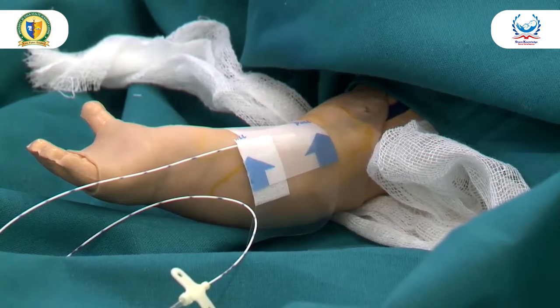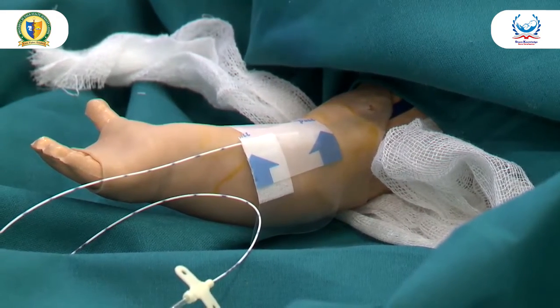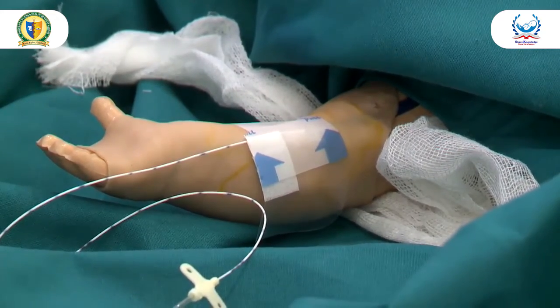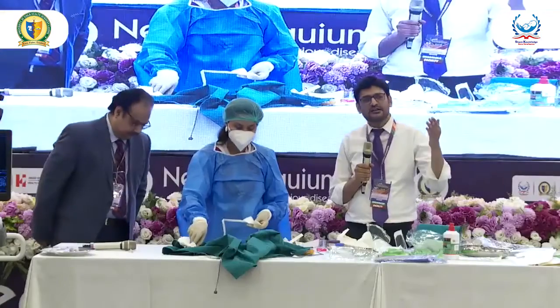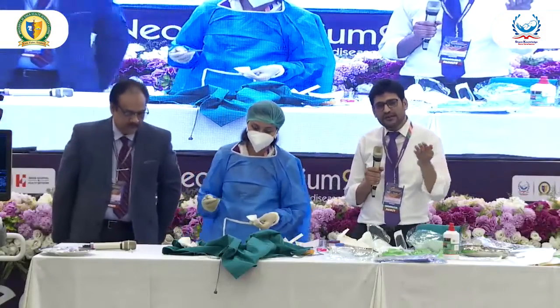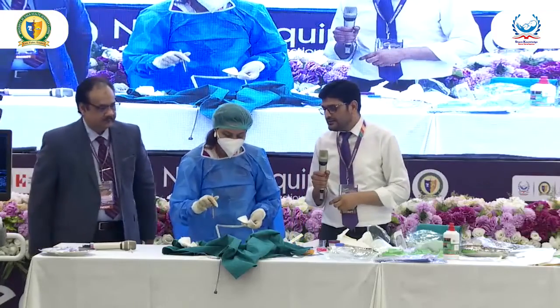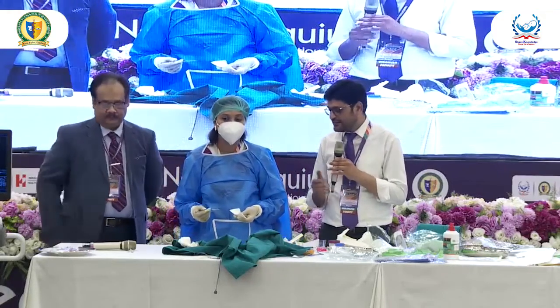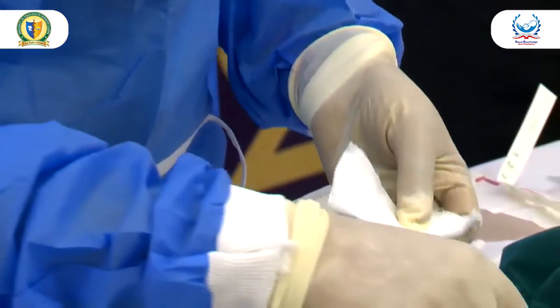When we have confirmed the position, that is just at the tip of the right atrium, at the junction of the right superior vena cava and the right atrium, then we will plan to secure it as the final securing. So let me ask you one question.